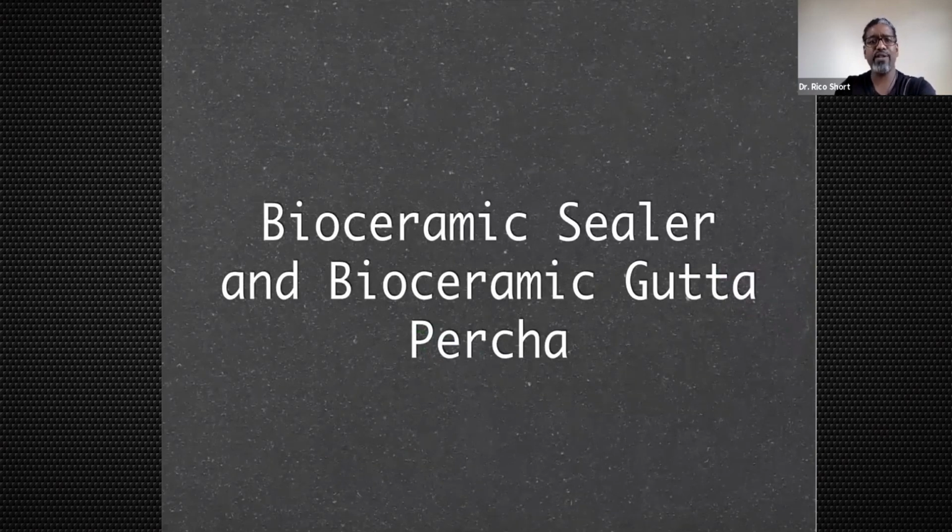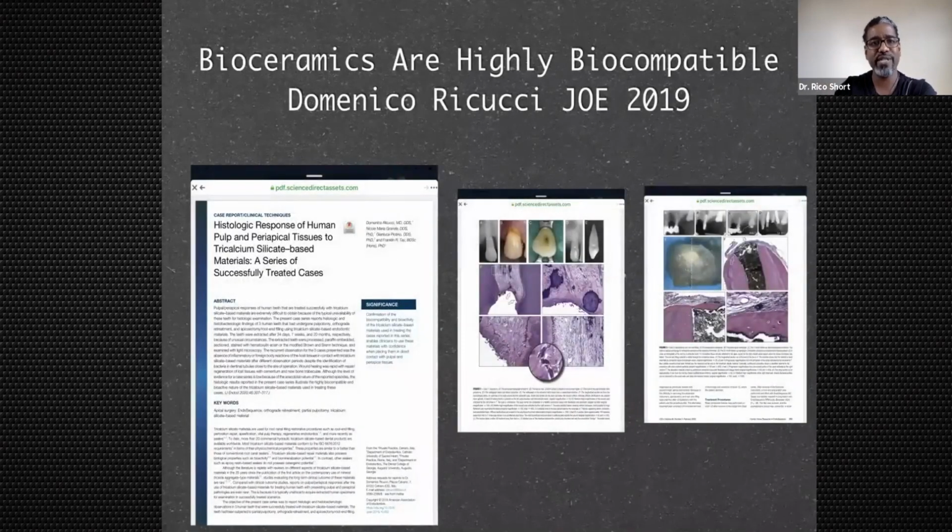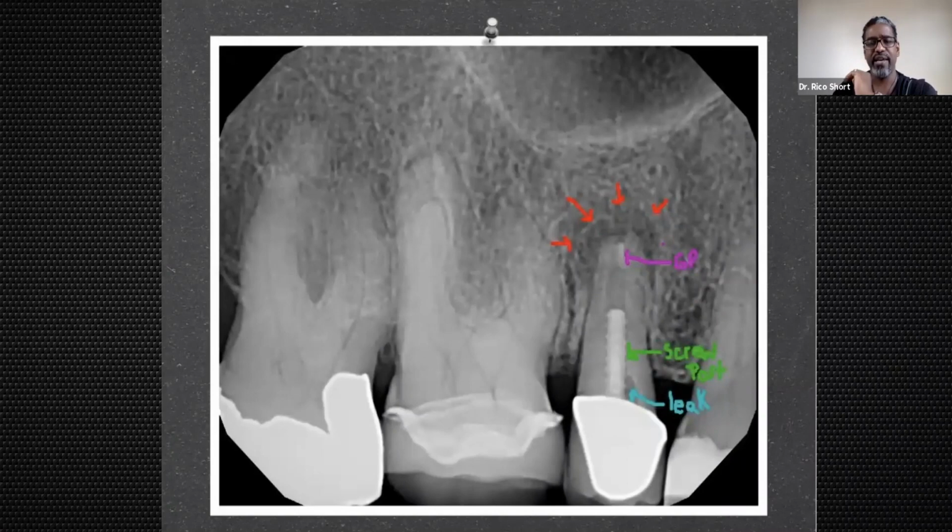We're going to talk a little bit about bioceramic sealer and bioceramic gutta percha. That's the new stuff that we're using now, bioceramic technology. It's great stuff. Domenico Riccucci talked about this in 2019. This is a nice histology, and it shows that these are some great tools that we can use at our disposal now versus the traditional sealer and traditional MTA.